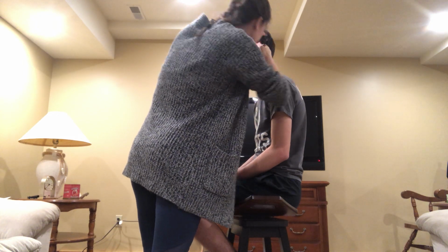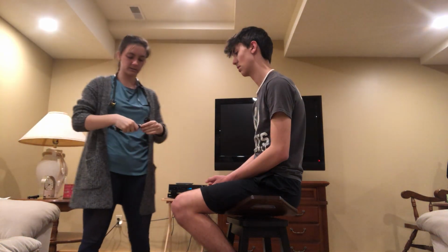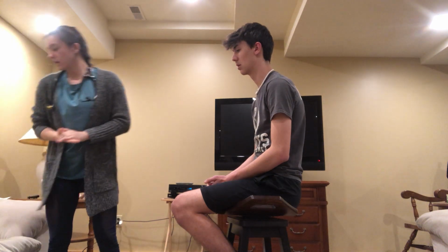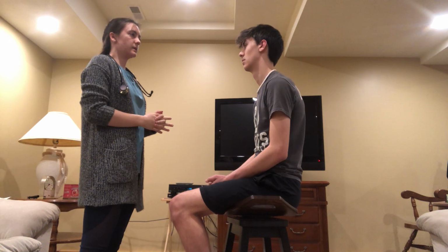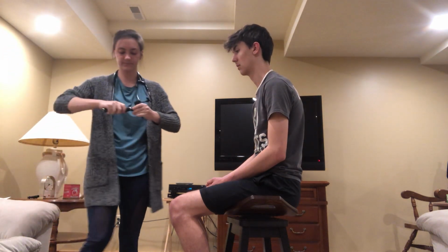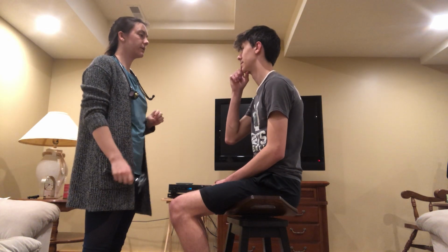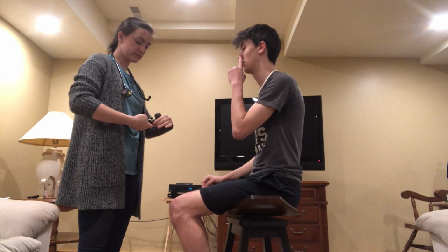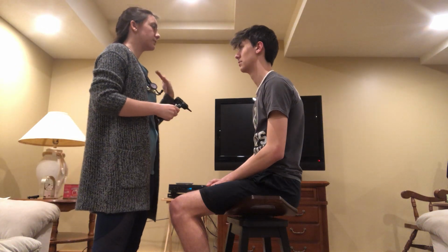Okay, that's it for that exam. I'm going to proceed with the nasal exam, but actually I'm going to put this back on. I'm going to ask my patient to go ahead and cover one nostril and breathe out, and then the other nostril. I'm going to use my otoscope and speculum to inspect the internal nasal canal.